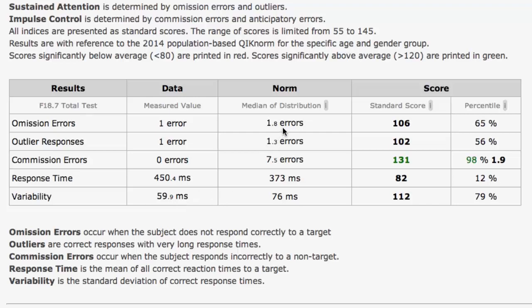We can see then the median of the distribution, which gives you a sense of where the norm is versus where this person is. The norm here is 1.8 errors versus this person's one error. That puts her slightly above average on the standard score at 106 — 100 is average on the standard score — which puts her in the 65th percentile. Percentile is over 100.